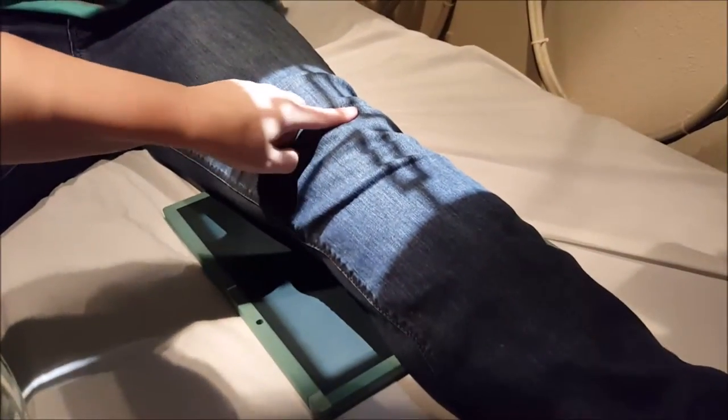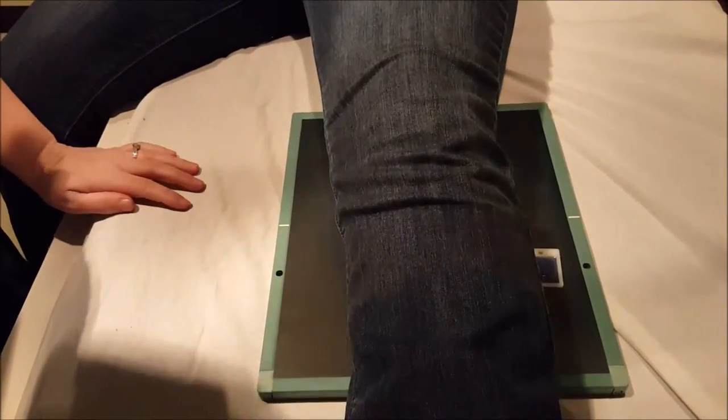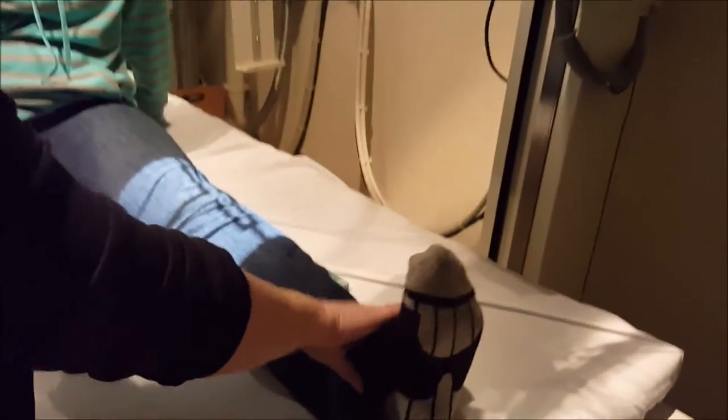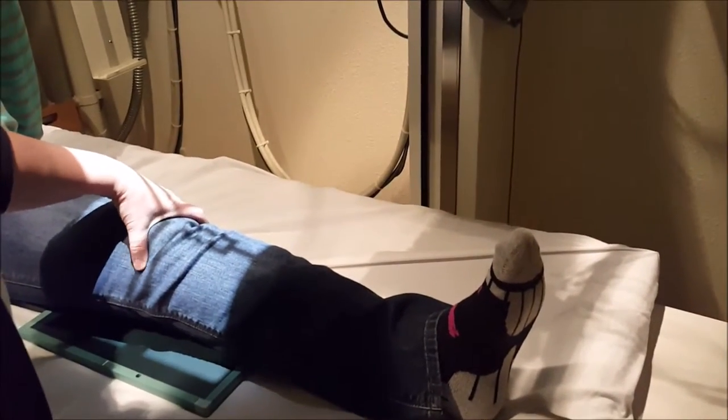So we're going to be centered a half an inch below the apex of the patella, so here's the patella, that's about a half an inch below the apex. So you want that to go right through the joint of the knee. We're going to keep our marker on the lateral aspect here, and we're going to collimate so that we're not just radiating everything needlessly. The toes need to be straight up in the air, so that way you don't have any rotation of the epicondyles.